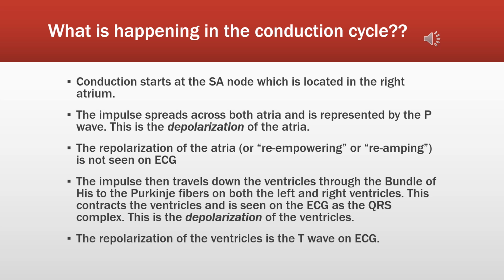The repolarization of the atria isn't seen on the ECG. It's covered up by the QRS complex, but the repolarization can be thought of as the re-empowering, or re-amping up, of the atria or ventricles.